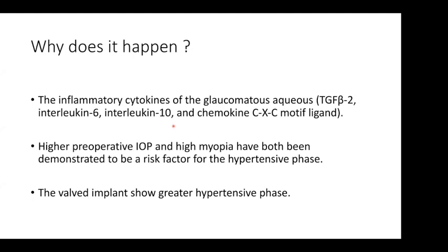Once this capsule is becoming mature, the pressure can go up. The capsule initially is thick, and then it becomes thin. As the capsule becomes thin, we can expect the pressure to go down, or the pressure will go up because of cross-linking that happens in the wall of this fibrous capsule.